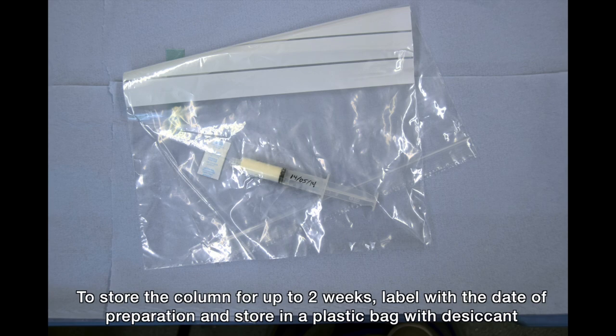Clean the outsides of the syringe with a clean dry tissue to remove any excess powder. If you wish to store the column for later use, label the column with the date of preparation. You can store the column for up to two weeks in a sealed plastic bag containing a desiccant sachet.